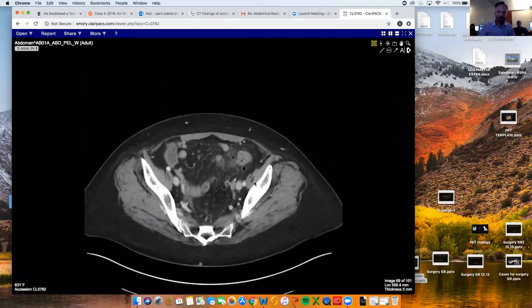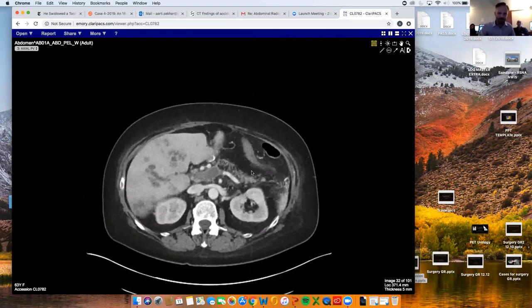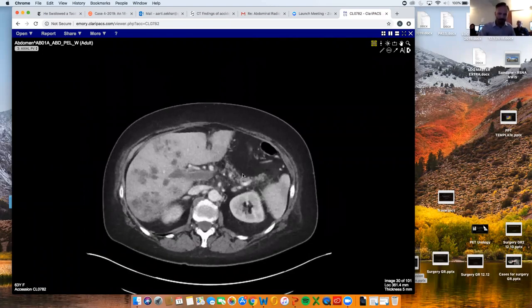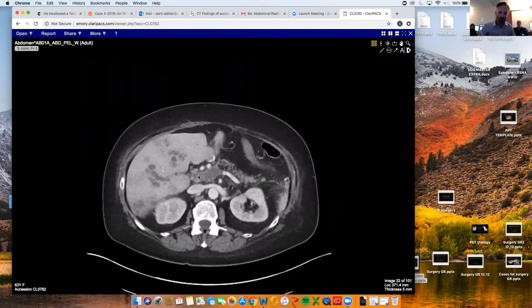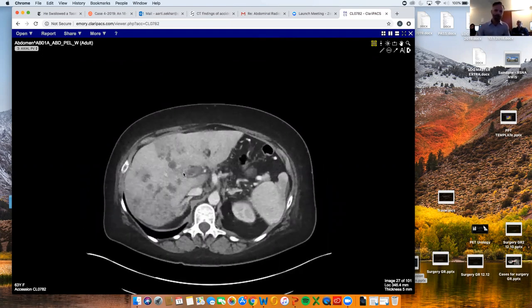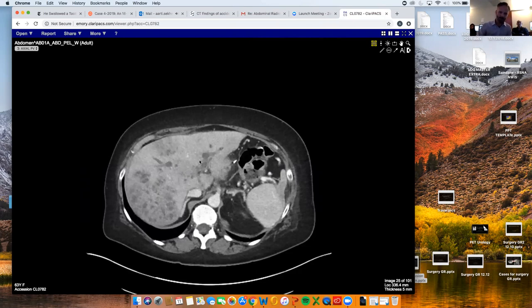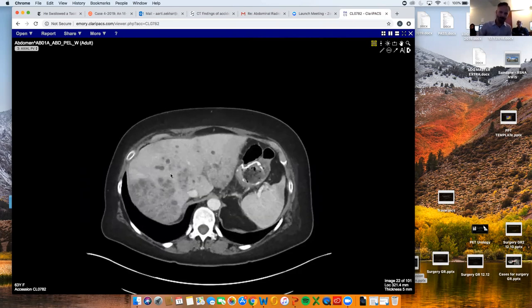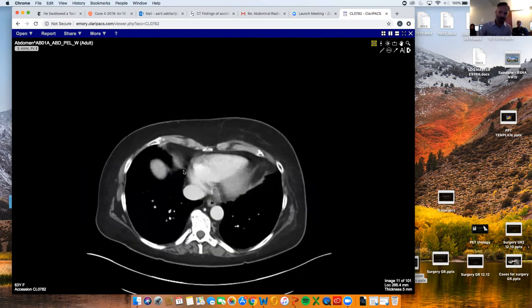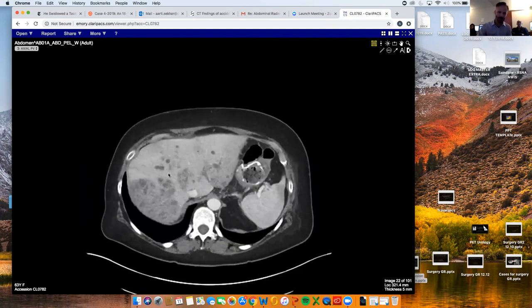So obviously she's got a lot going on. We see in the liver — here's her portal vein, completely thrombosed. And then as we go through the liver, you can see that literally every single branch of her portal venous system, all the way from the hilum all the way out to the edge of the liver, is completely thrombosed.